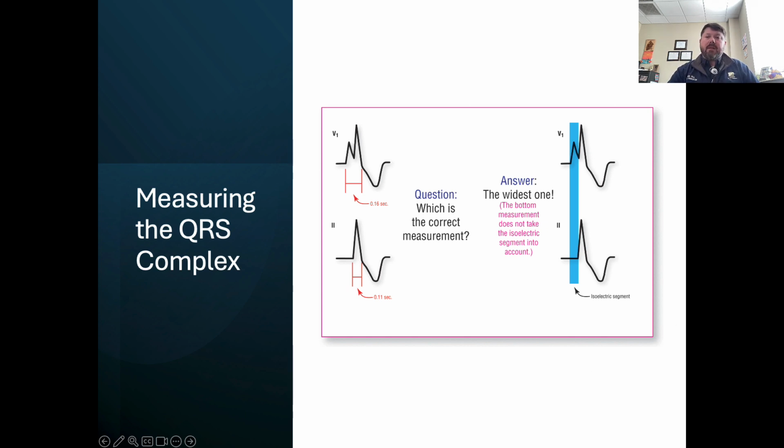In a ventricular complex, ST segment and T waves will always be abnormal and may be inverted, elevated, or depressed. This occurs because of abnormal patterns of repolarization associated with the ventricular complexes. And again, because you've got the cell-to-cell electrical transmission, you're going to have a prolonged depolarization and also a prolonged repolarization as well.